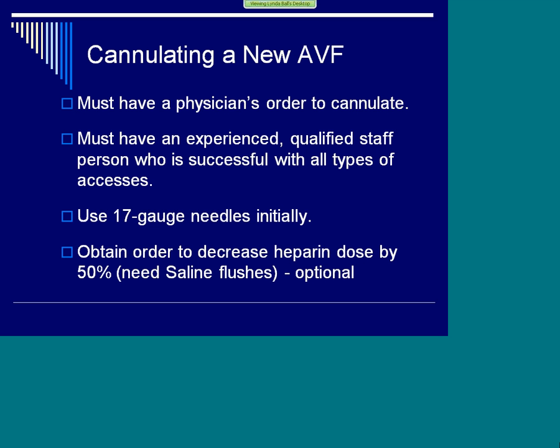So when we cannulate new fistulas, you need to have a physician's order to cannulate, and then you need to have the qualified, experienced person who can deal with all access types, who knows how to appropriately do an assessment, who knows enough about their skill set to be able to say, no, I think I'll infiltrate this. Because if you stuck it and you went, darn it, I knew this was going to blow, then we shouldn't have done it in the first place. All right, that's what I mean by knowing your limitations and saying this isn't ready.